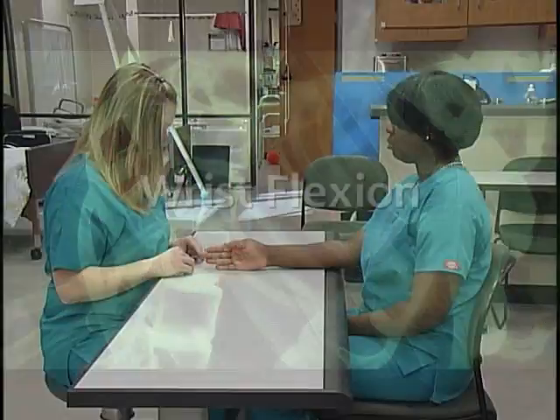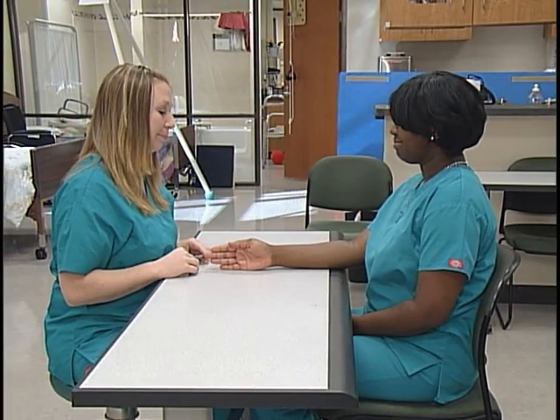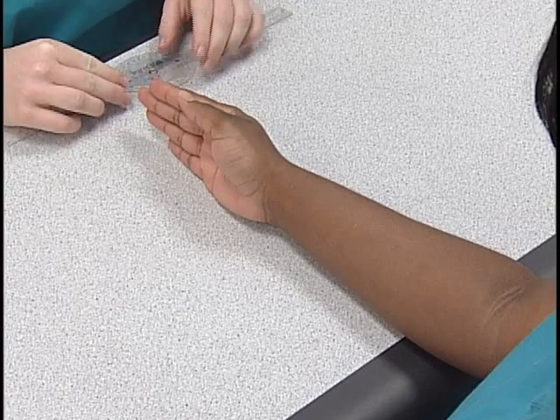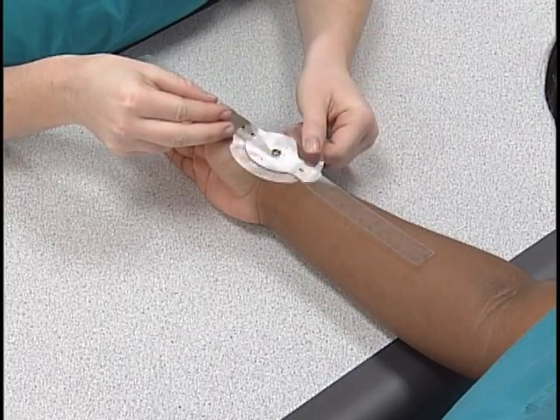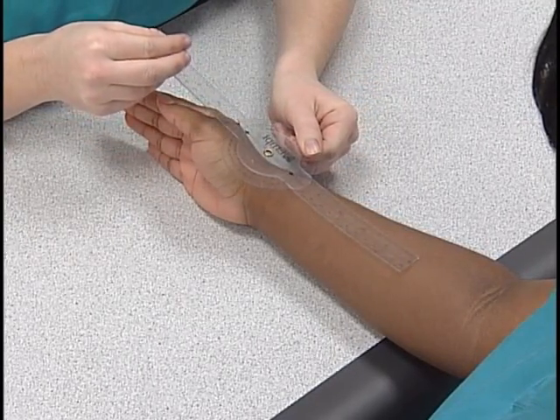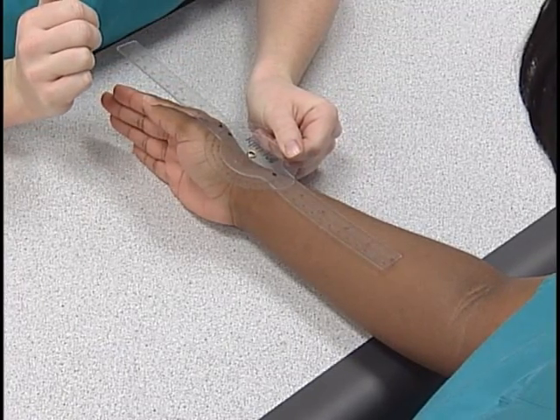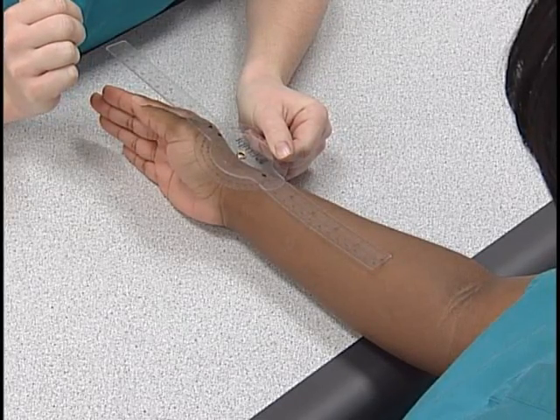For wrist flexion, the subject is seated with the forearm in mid position and the hand and forearm resting on the table on the ulnar border. The axis of the goniometer is on the lateral aspect of the wrist, just distal to the radial styloid and the anatomical snuff box. The stationary bar is parallel to the radius and the movable bar is parallel to the metacarpal of the index finger.